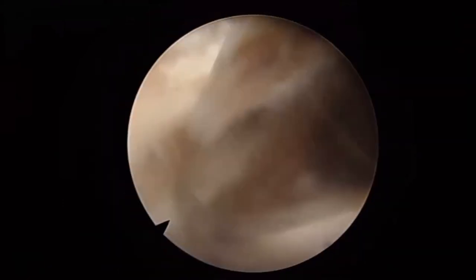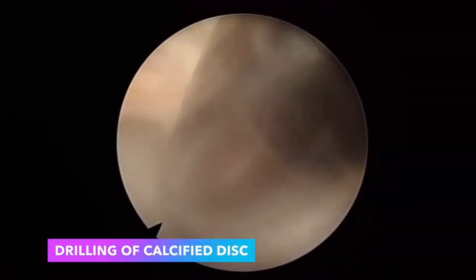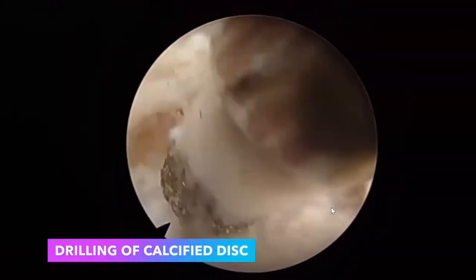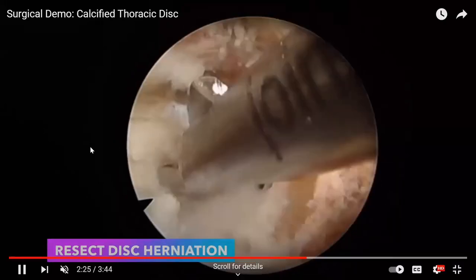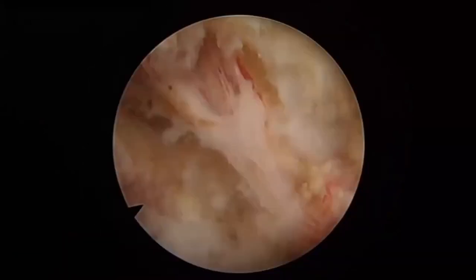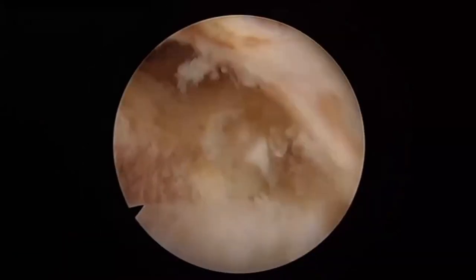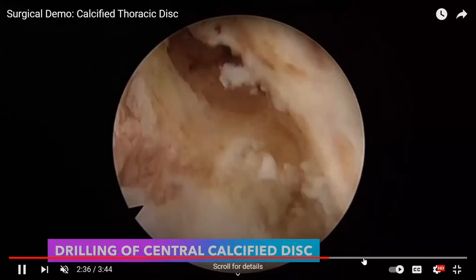So you see here, John is drilling into the vertebral body a little bit, again, to create a little pocket to flick the disc into. And I'm just going to go forward here so you could see that later. So he's grabbing the disc and flicking it into the pocket that he created. And slowly over time, you'll see that the dura will expand and everything will be a lot more free.